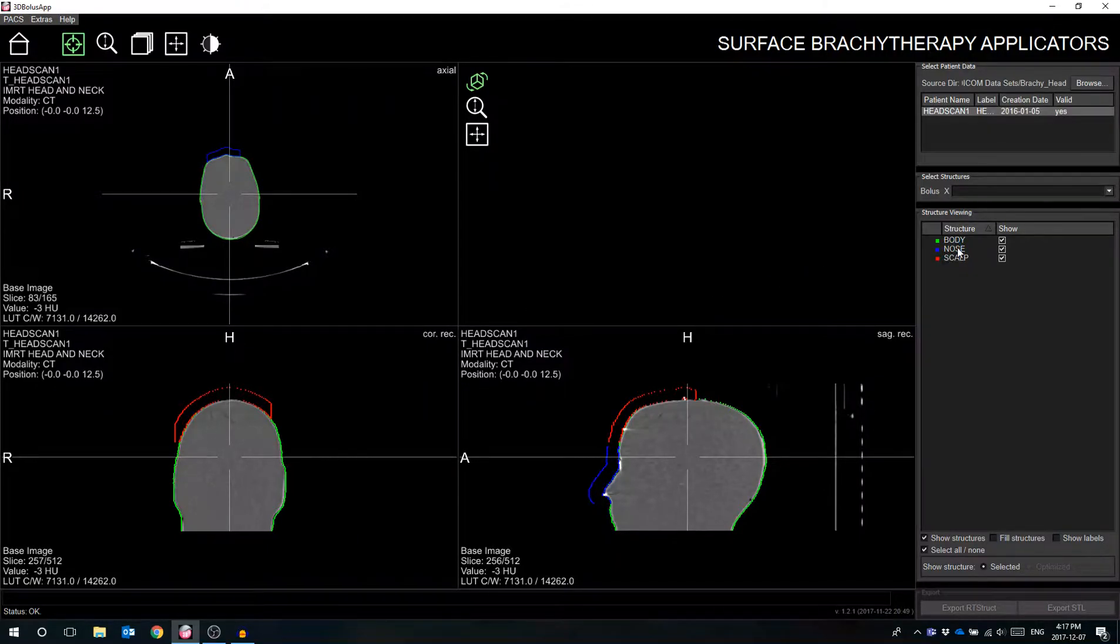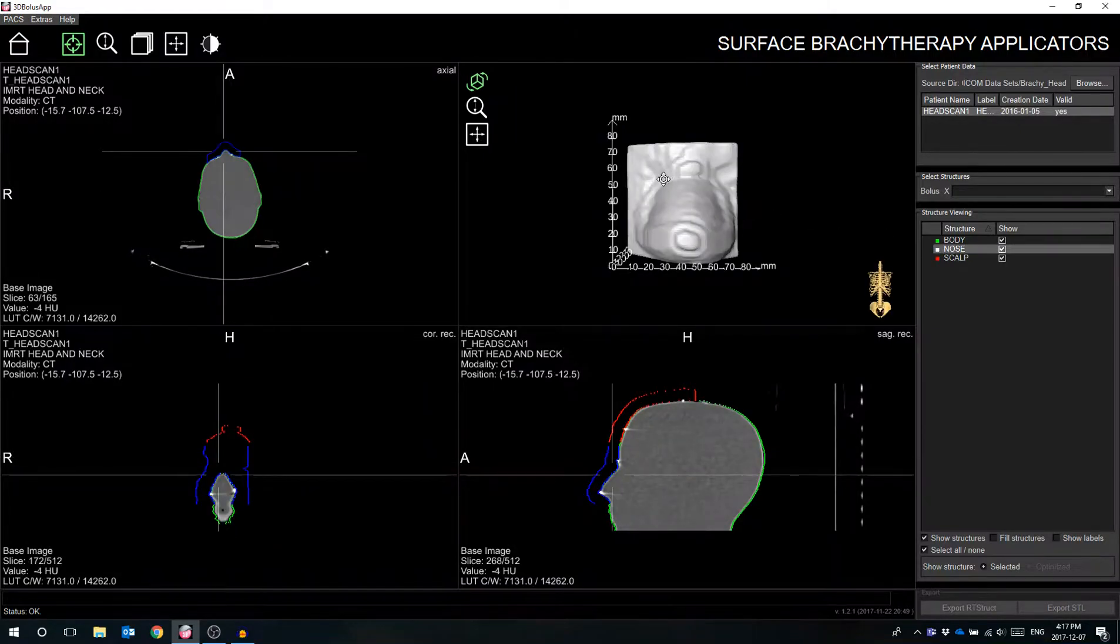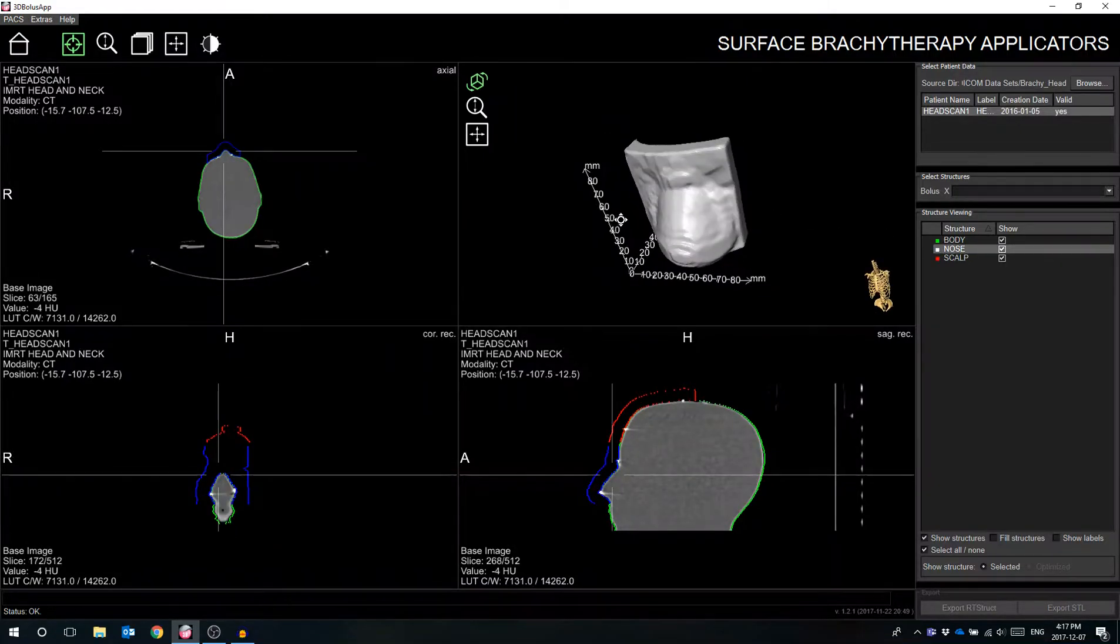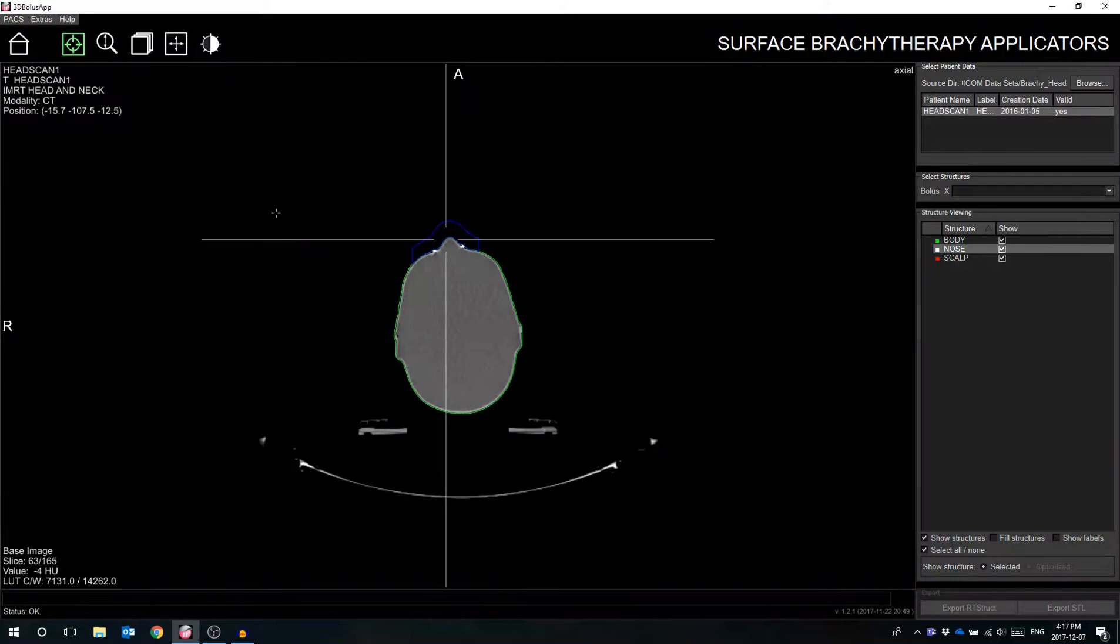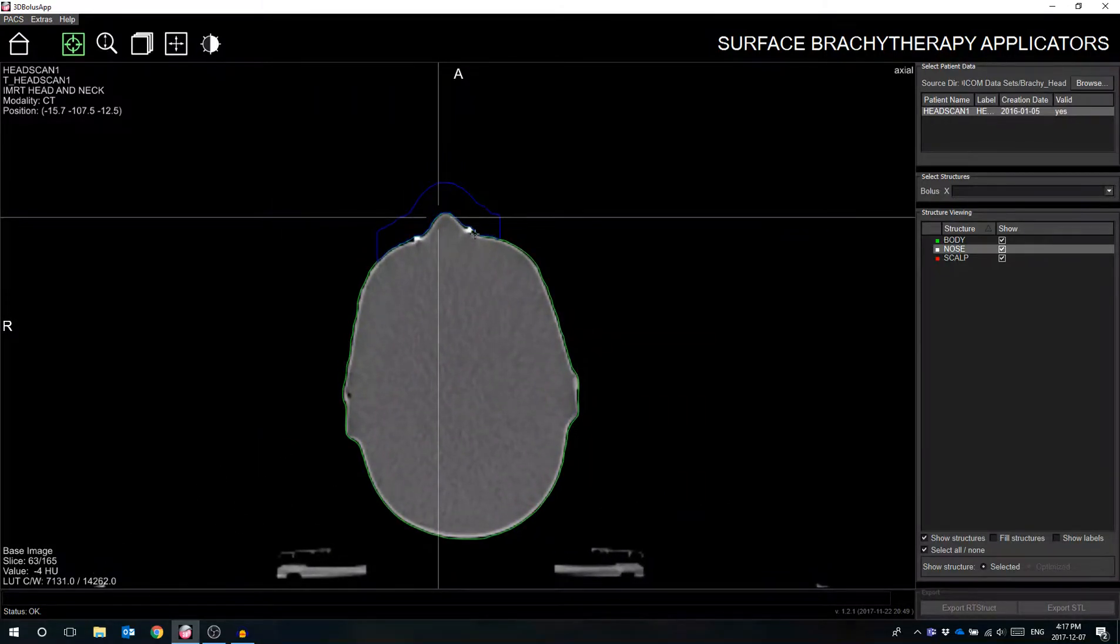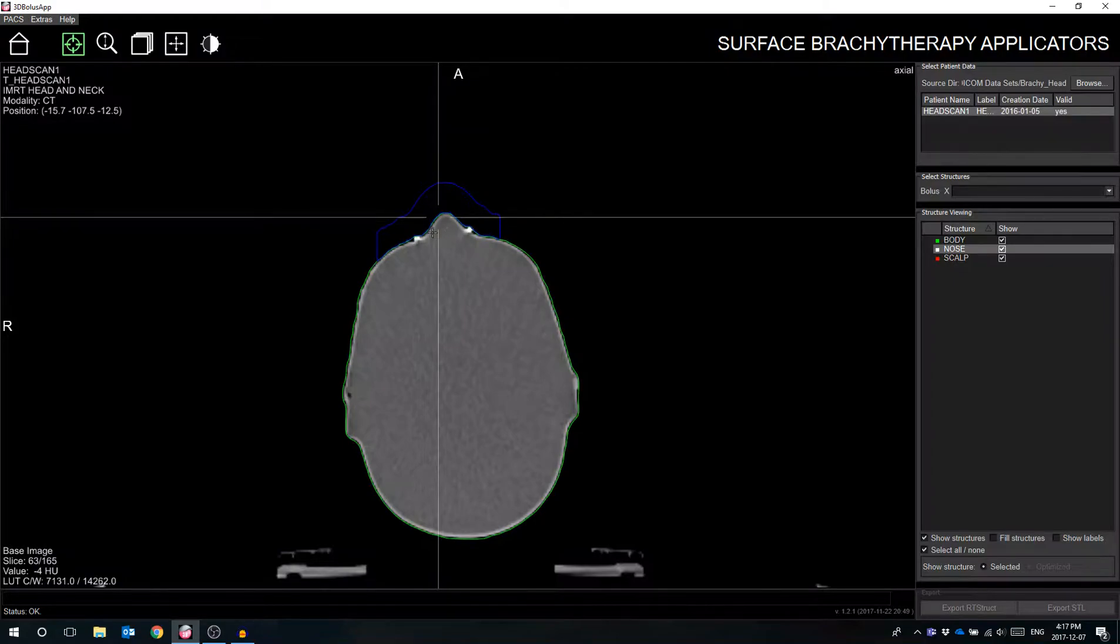The structure set must include an object for the 3D Bolus software to modify and add catheter trajectories. This applicator structure is typically increased by a margin of 2cm in all directions around the treatment volume to ensure complete coverage.